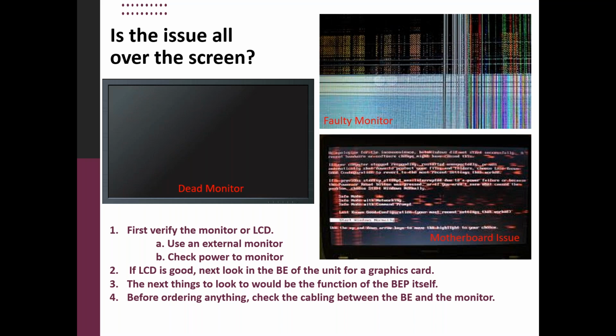And then the last thing I would say about this is before you order anything, monitor or install monitor or back-end processor, I would check the cabling between the back-end and the monitor. The reason for that would be that in today's world, most of those things are wired up through articulating arms, and they are moved and flexed and sometimes pinched inside that moving arm.